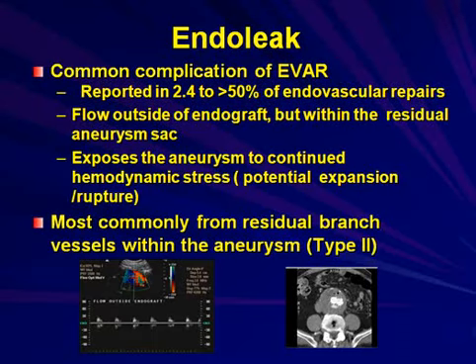Endoleak is a very common complication after EVAR. It's reported in up to 50% of endovascular repairs. In the two major FDA trials done in the United States, there was a 30% endoleak across all time points. This is defined as flow outside the endograft but within the residual aneurysm sac and exposes the aneurysm to continued hemodynamic stress that would lead to potential expansion with the risk of rupture.